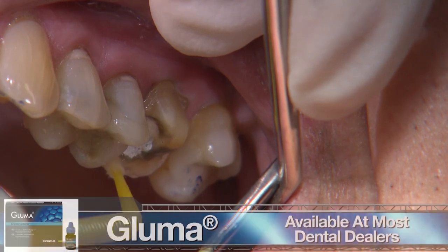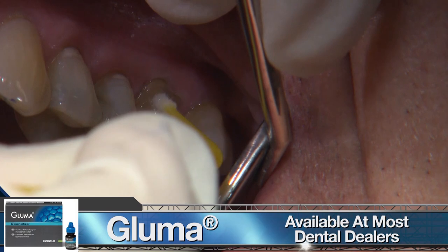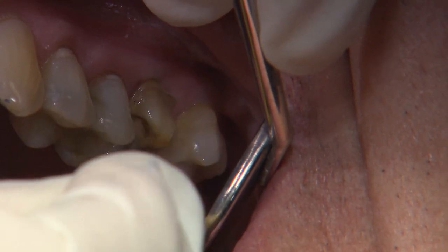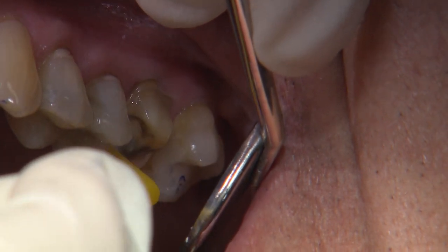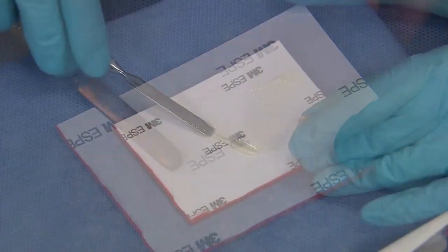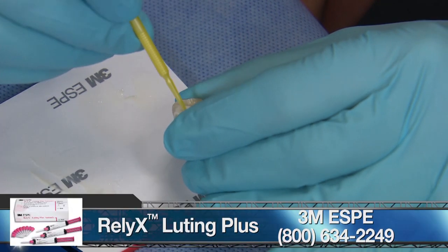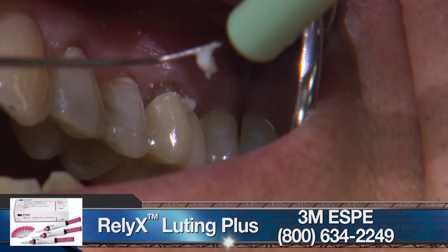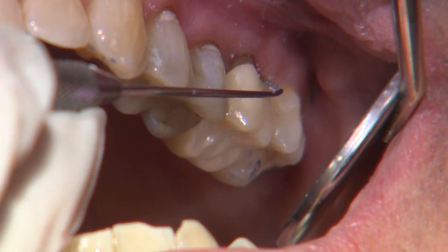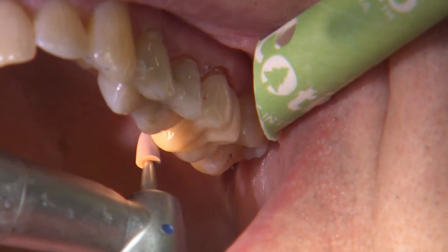Prior to delivering the crown, I scrub a thin layer of Gluma desensitizer on the prep and allow it to sit for at least a minute. The solution will help disinfect the tooth and reduce the chances of post-operative sensitivity. Any conventional cement or resin cement of your choice may be used with this Bruxer Now material. For this delivery, we're using 3M's resin-modified glass ionomer RelyX Luting Plus — it's very easy to use with a pretty quick cleanup. After the crown is cemented, it's always a good idea to check the occlusal contacts again.